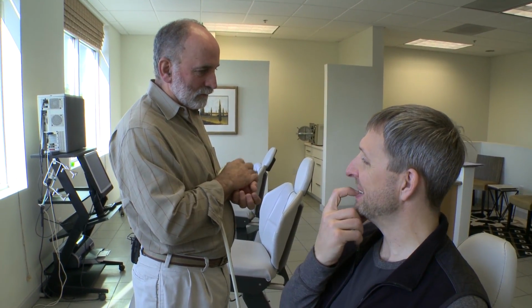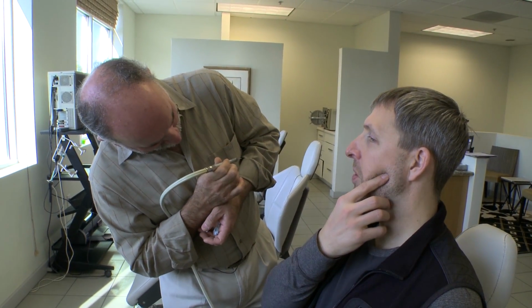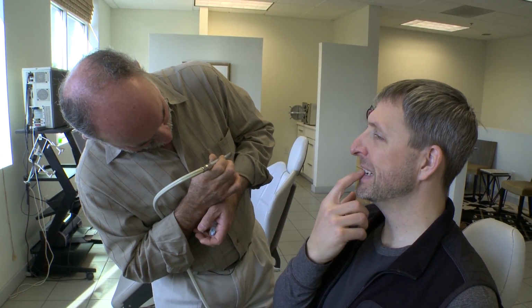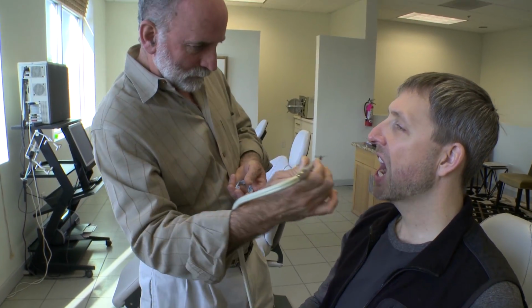Yeah. Left side for sure. I can feel the left molar hit now. The right one still isn't hitting, but the front left is hitting. Okay. Good.